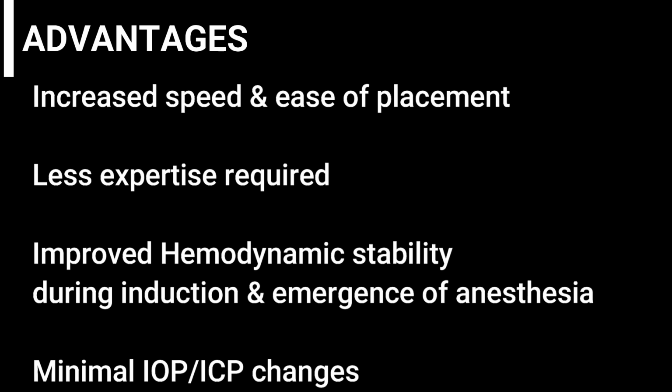Advantages. It has increased speed and is relatively easier to place. It needs less expertise. It provides improved hemodynamic stability during induction and emergence of anesthesia. It has minimal IOP and ICP changes, and it has increased airway tolerance.